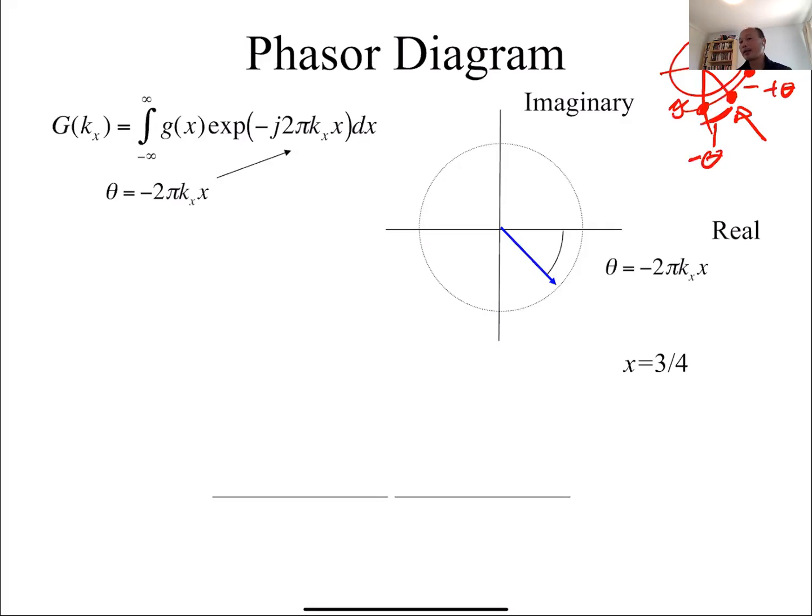They're all spinning really fast, very close to 42 million times per second. They're all spinning clockwise very quickly. It's just that minor difference in how they're spinning with reference to the spin at the center of the magnet that we care about in the rotating frame. All right, does that help?